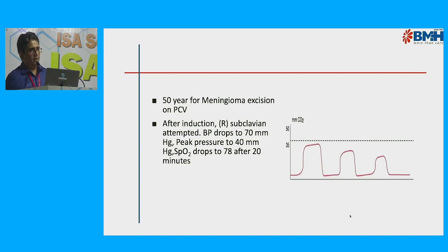Can you tell me? It could be a possible pneumothorax. In pneumothorax, the shape of the capnogram will depend upon the tidal volume delivered, which is a function of the mode of ventilation. So in pressure controlled ventilation, there will be a decrease in the tidal volume and a gradual increase in the EtCO2 initially. When tension pneumothorax develops, there will be a decline in the cardiac output, resulting in a decrease in EtCO2, because hypotension is there, and sampling air will be less.